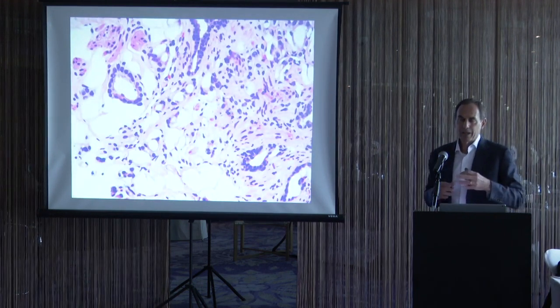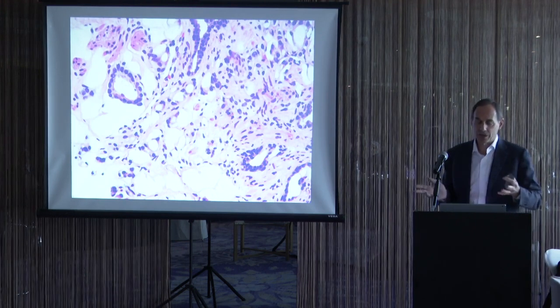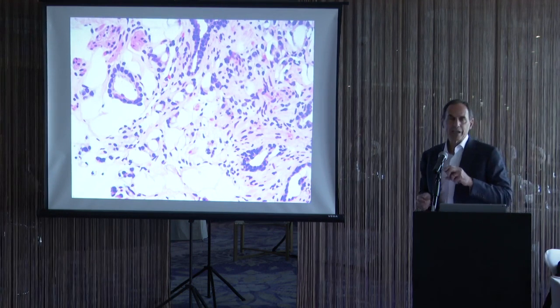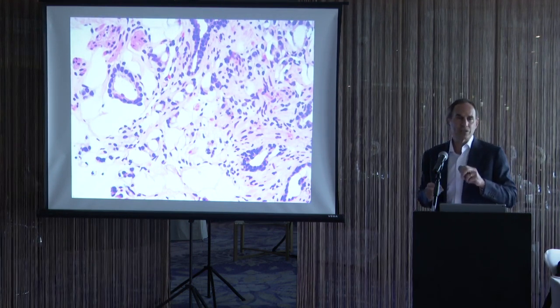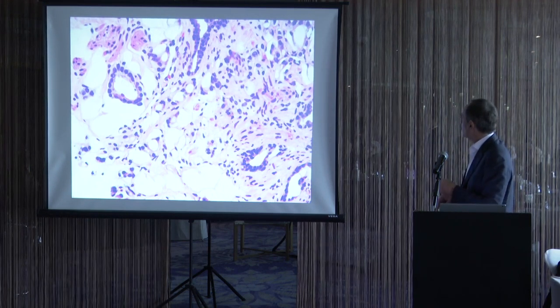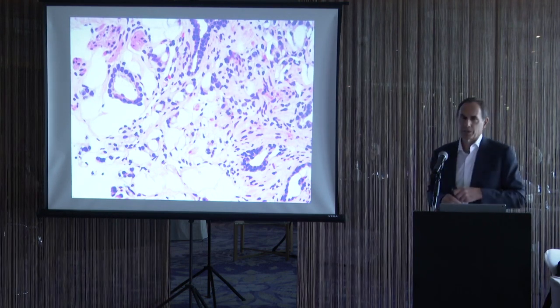In contrast to many other organs, we can see mucocele-like reactions in breast cancer, for example. In the GI tract, we get mucin extravasation with benign glands. In the prostate, you do not get mucin extravasation with benign glands. So if you see some small, atypical glands suspicious for cancer with extracellular mucin, that has to be prostate cancer.